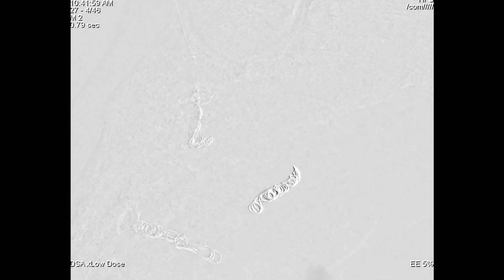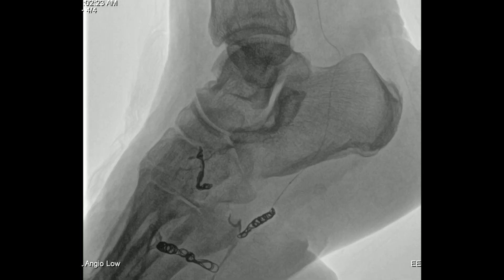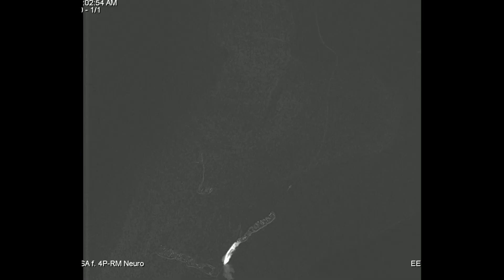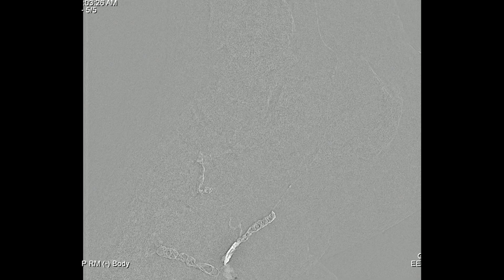There was still some flow coming down through the main branch of the anterior tibial artery, so we went back into the posterior tibial and backed up those coils by injecting some onyx. Again using the roadmap function, you can see the onyx sneaking its way through the coil and into the side branches.